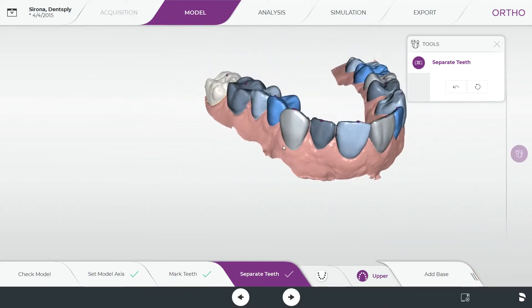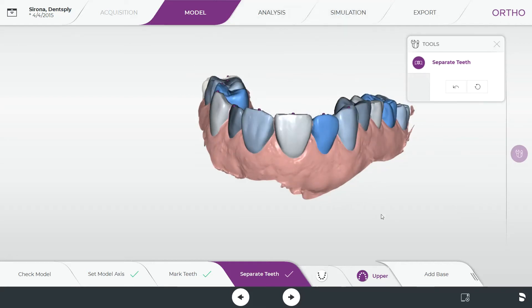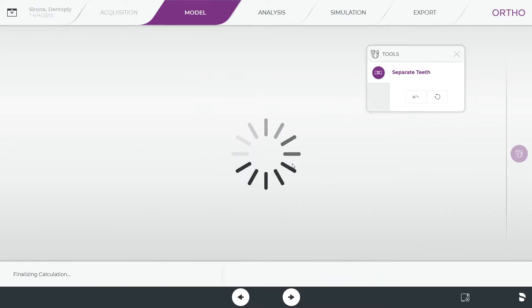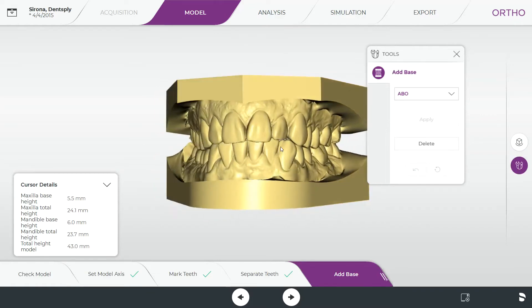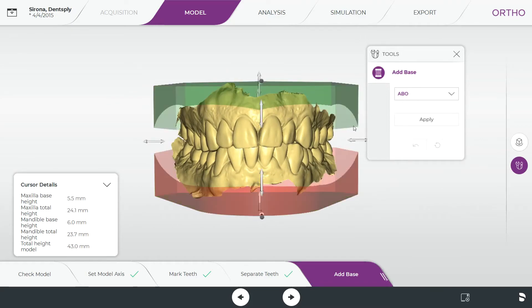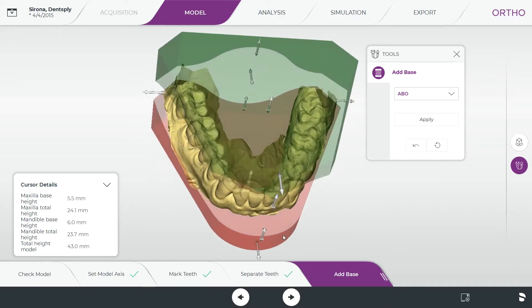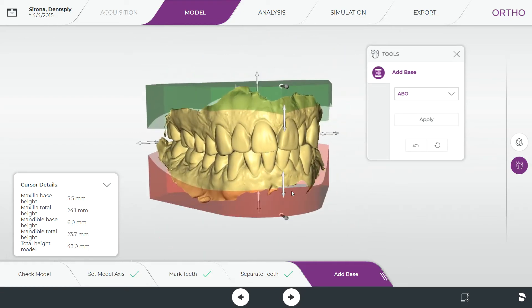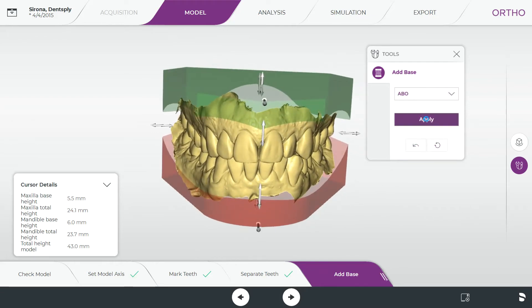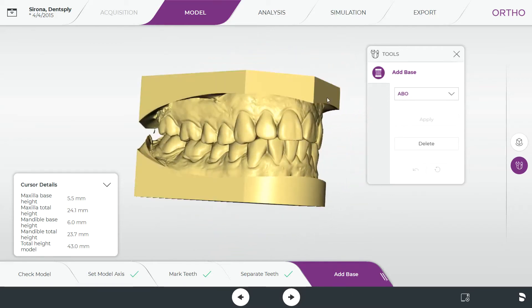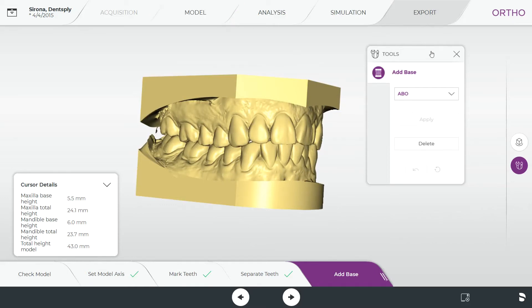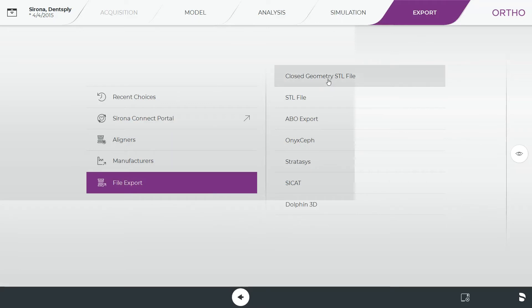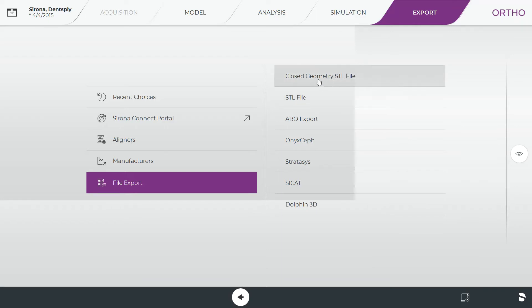Before moving on to analysis and simulation, you can also add a base to your models for 3D printing — the software will automatically add one. You can hit delete to customize the base shape, scaling it down to save resin, and choose from different base options. Hit Apply when you're happy with it. To export for 3D printing, go to Export, then File Export, and select Closed Geometry STL — that exports your scans with the base. A plain STL is an open scan with no base, which is hollow underneath, so for 3D printing you need the Closed Geometry STL.